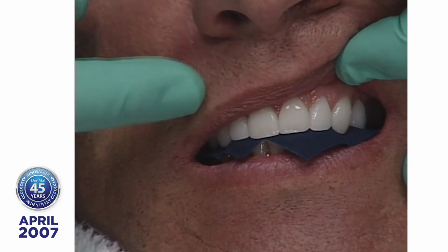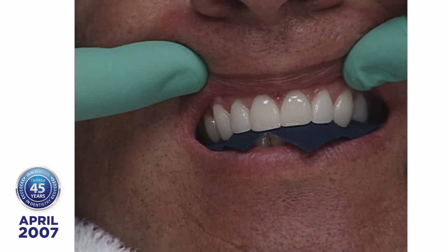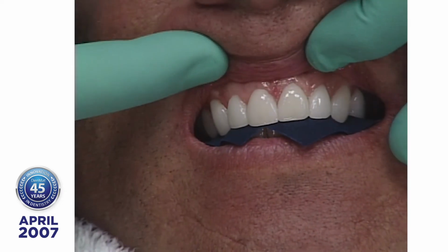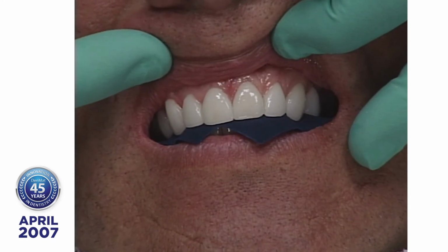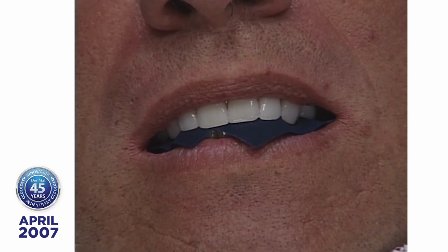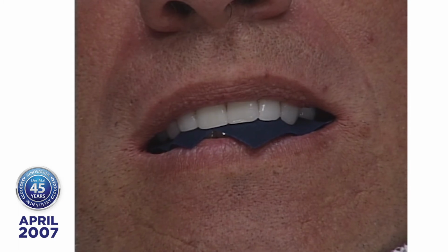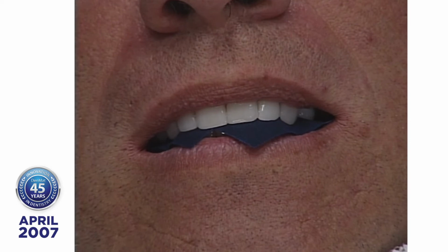This is run-of-the-mill. I don't get pick of the litter. I send it in, and this is what's done for me or done for you. If you want something different than that, I usually just give the instructions to the studio to give them a shade. I usually take shade B0, B1, 50% translucency, and I ask them to make it look nice, and this is what they give me. If it doesn't look nice enough, I send it back, and they make it look nicer.